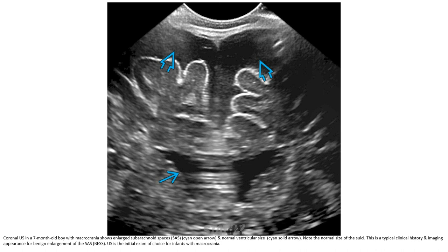This is an ultrasound image of a boy with marked macrocephaly showing large subarachnoid spaces and no significant ventricular enlargement. Note the absence of mass effect.